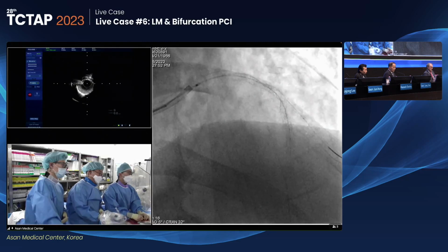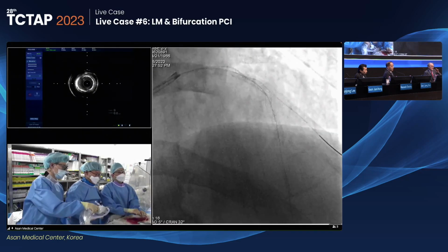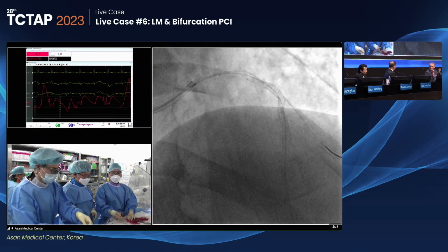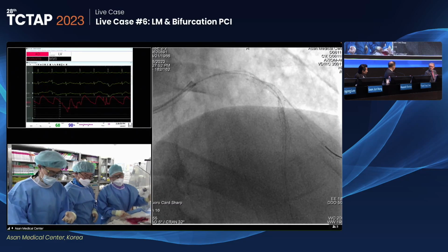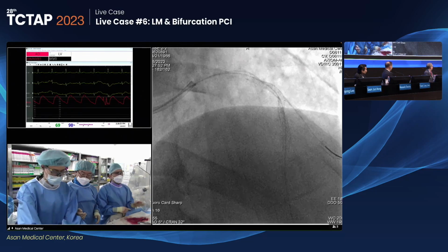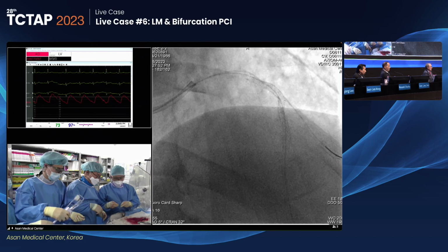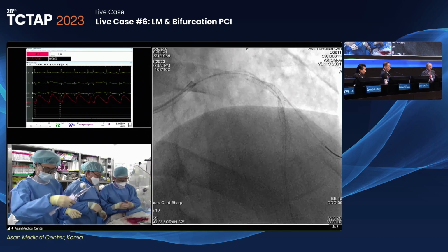I would re-POT. I will not go before. Yeah. After POT, why don't you post-dilate? No, I will NC post-dilate before doing that. The patient is stable, flow is good. I do not mind. You have to post-dilate anyway, so I think it's... Oh, yeah. I will not.